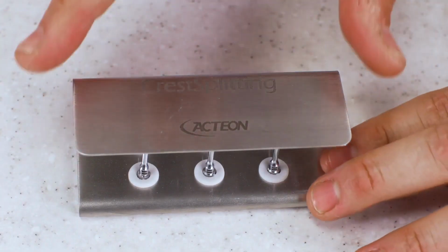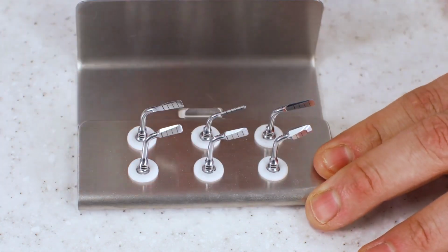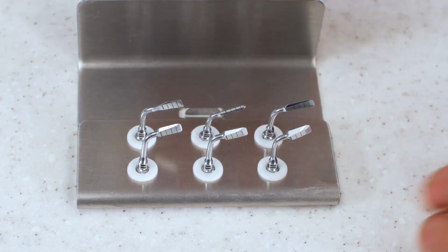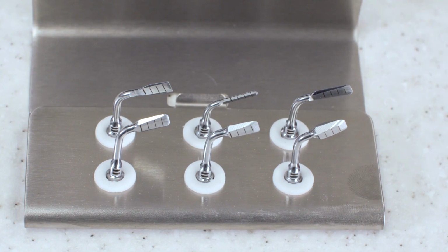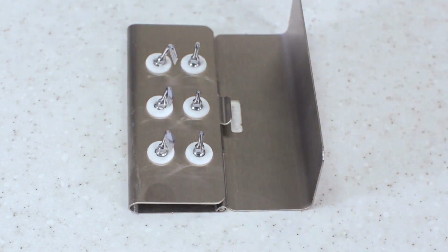Here we have the crest splitting kit. So this is more for ridge splits. You can see there's all kinds of different sizes and shapes of bone splitters in here. This cuts through up to 8 millimeters deep. You can see there's little 2 millimeter line markers, 2, 4, 6, 8 that you can see on the individual tips.